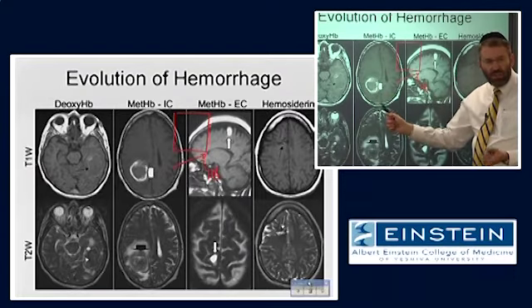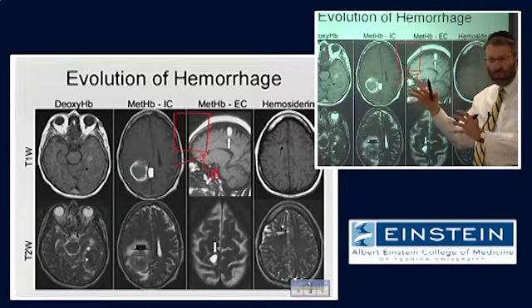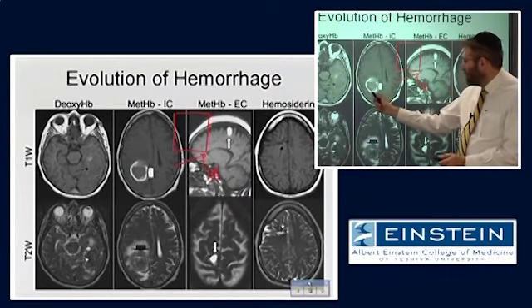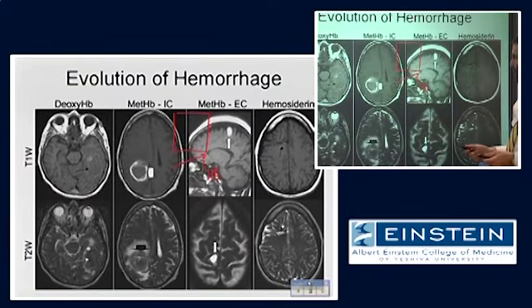That's what we all expect, is that the evolution of the hematoma should occur most rapidly or earliest at the periphery and then move in. So that's the contrast between a simple conformational change in the molecule allowing that proton-electron dipole effect to occur. And then it persists in the case of extracellular methemoglobin, and it's gone in the case of hemosiderin.